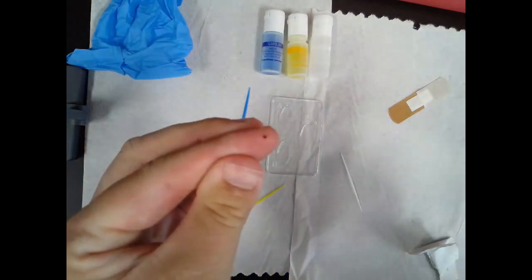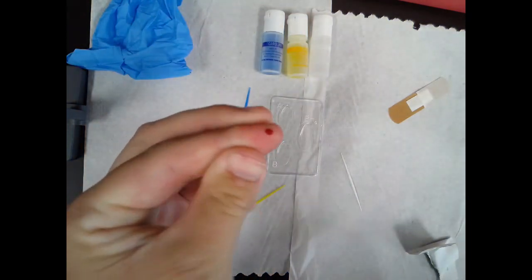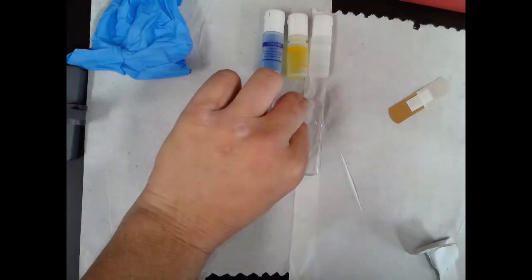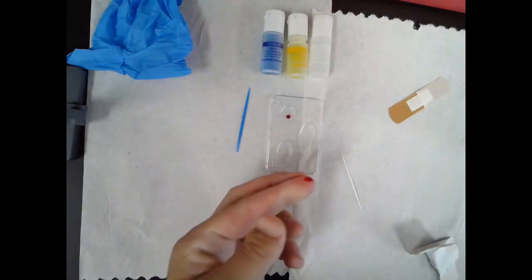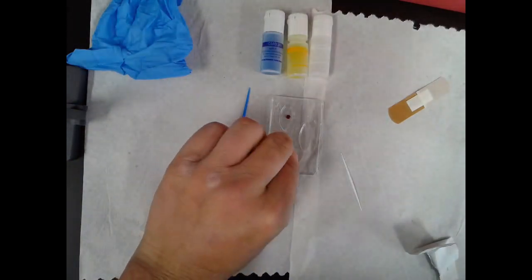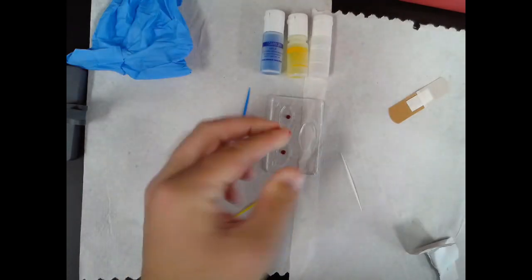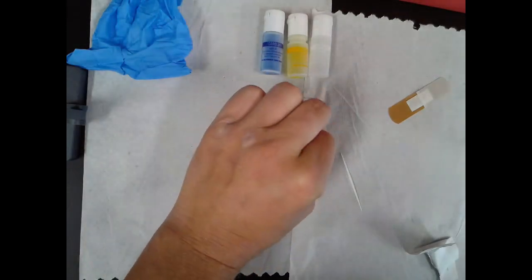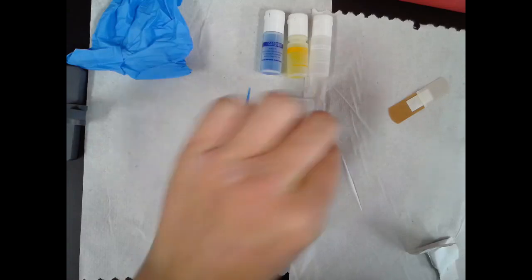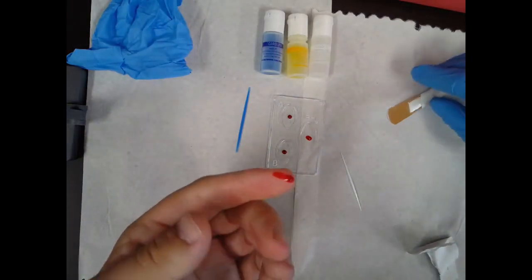I'm just joking. All right. Now you can see the blood is coming out. One drop. Two drop. Three drops.